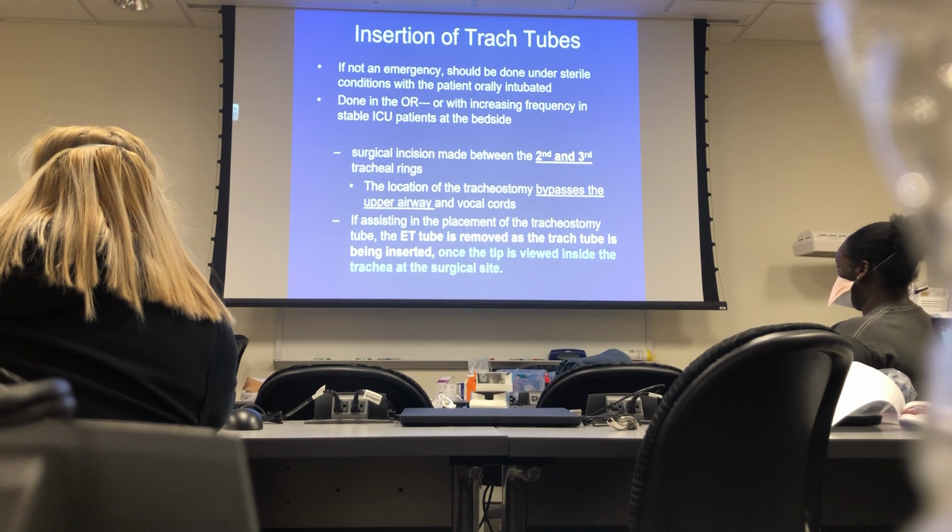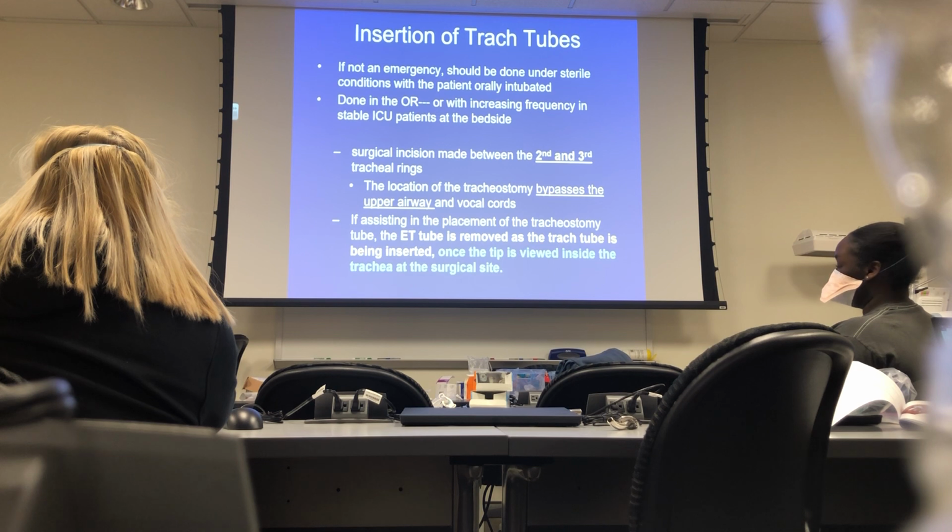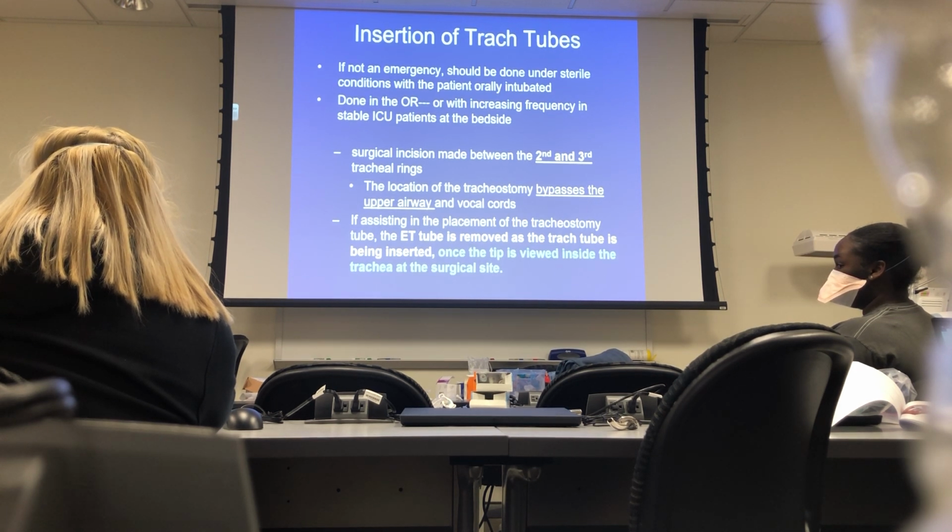Question on the boards is, as the trach is going in, when is the ET tube pulled out? The ET tube is pulled out when the end of the trach is visualized in the trachea, then you pull the ET tube out, okay?